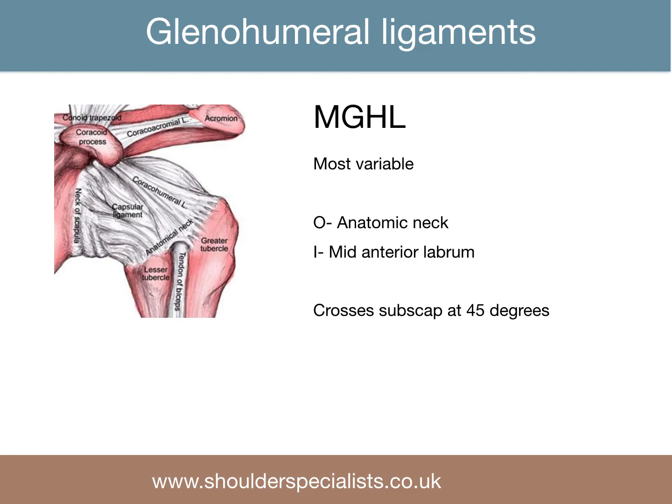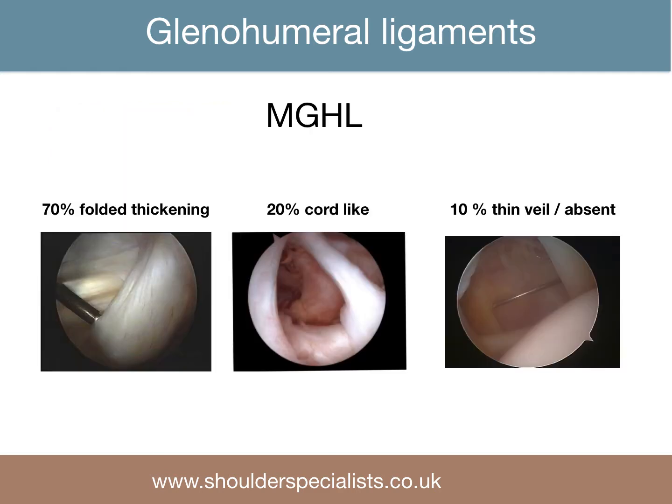The middle glenohumeral ligament is the most variable of all. When viewed arthroscopically, it crosses behind the subscapularis tendon at an angle of 45 degrees. In about 70% of shoulders the middle glenohumeral ligament is a thick folded band; in 20% it will be cord-like, and in 10% it will be a very thin veil or even absent.